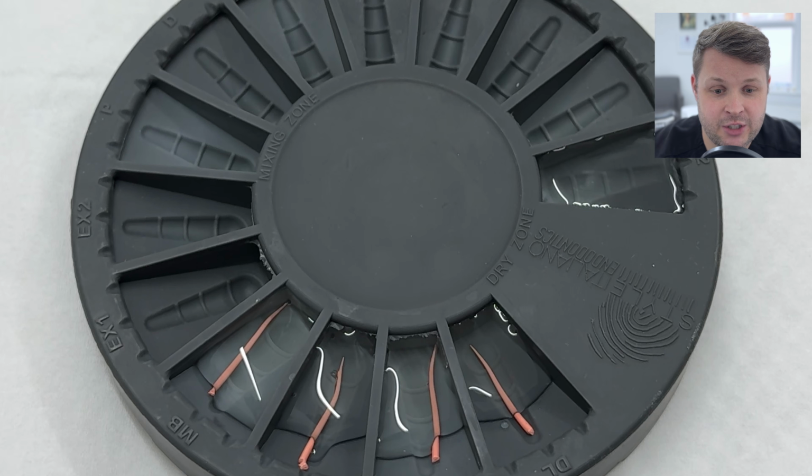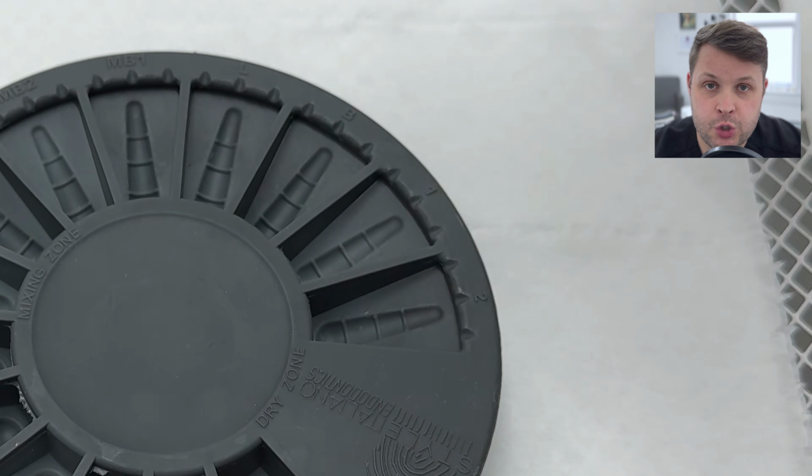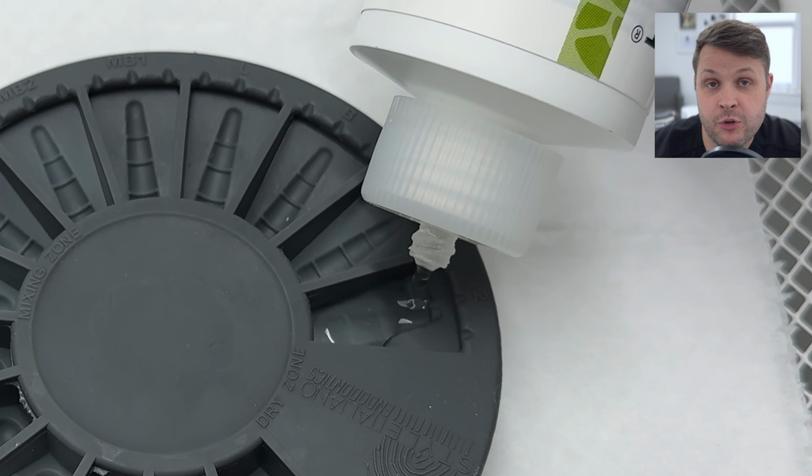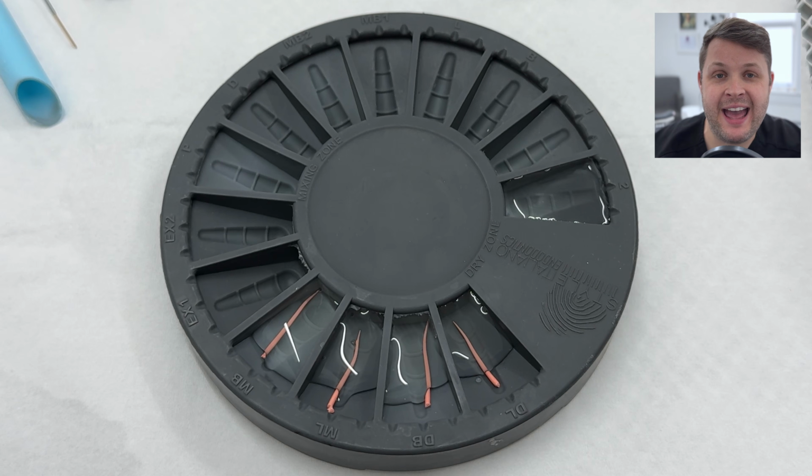It also has a nice little dry area, and what I mean by a dry area is in the middle. My nurse likes to place paper points in this place. And it also serves as a well for my EDTA to be placed in. So it's an all-encompassing area for me and my nurse to gravitate to. She knows where to put things, and she knows where to put the EDTA, and I know where to suck things up. It just makes the obturation part of the root canal really efficient and easy. And if you've got a new nurse, you can just tell her this is the obturation area, if that makes any sense.